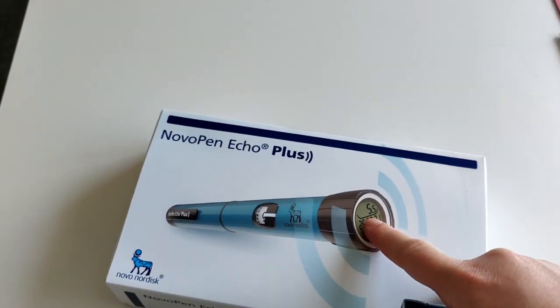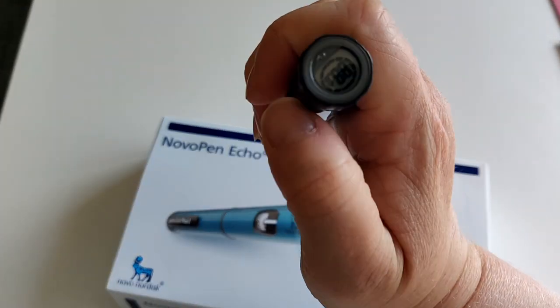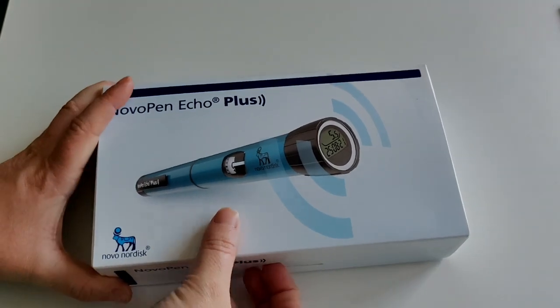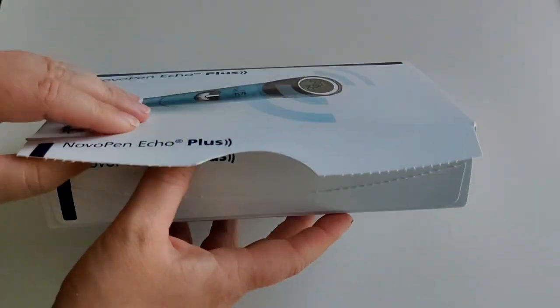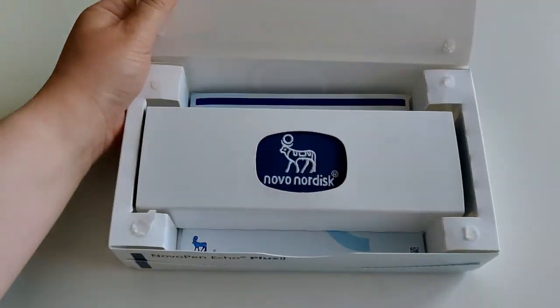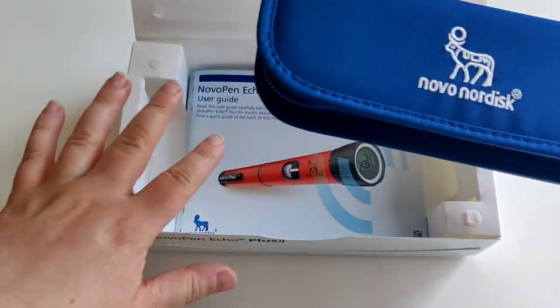The old pen shows the amount of units you've taken — five and a half — but the Echo Plus also has the date and time, which the old pen doesn't have. The only thing on the old pen is how much was taken last. Anyway, I've waited long enough — let's open this up! I'm so excited to have a smart pen. I went to my clinic, I needed a new pen, asked them, and they said 'oh we have a smart pen, do you want it?' And I was like yes!